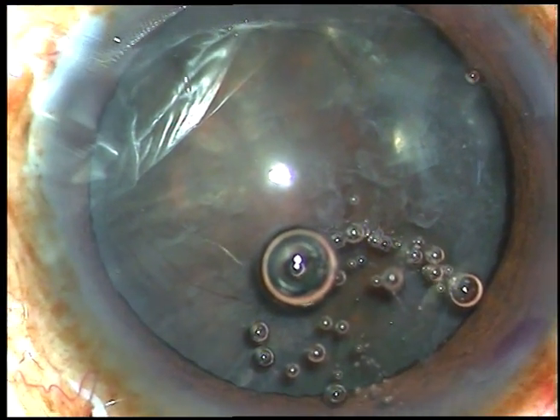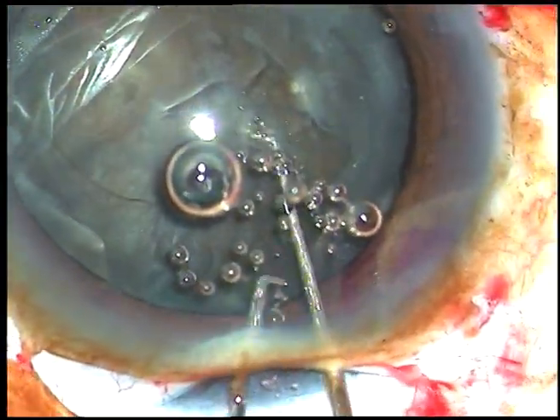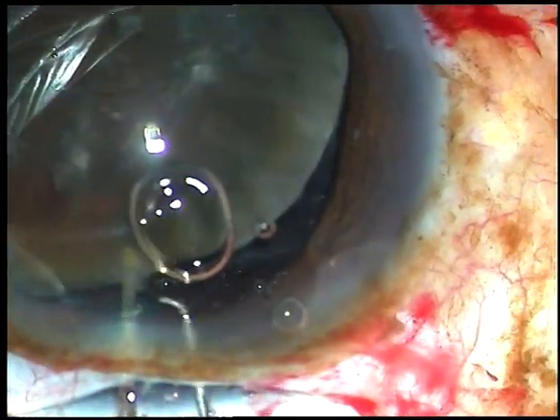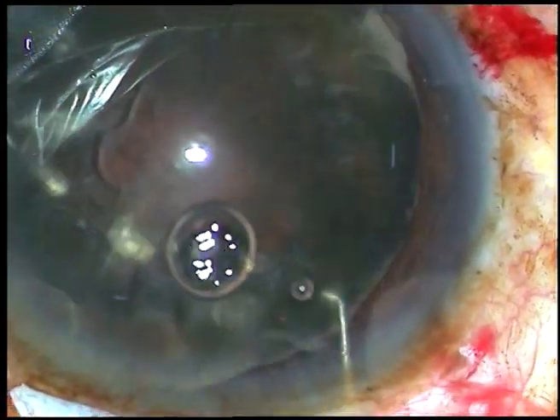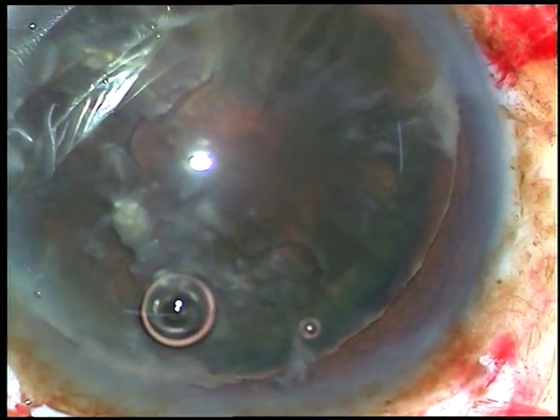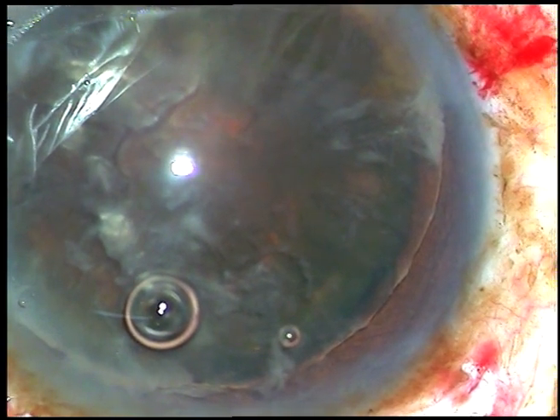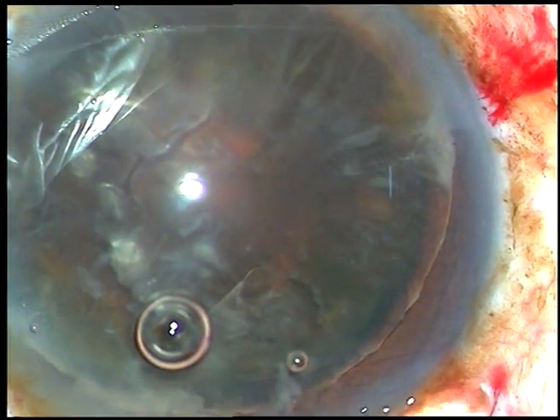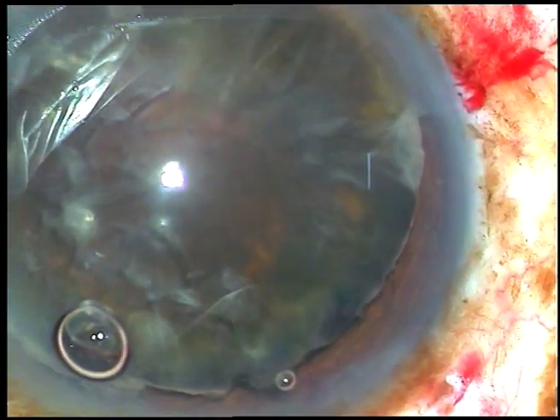Now the nucleus has to be prolapsed into the anterior chamber. Here I take two instruments — one chopper in my left hand goes behind the nucleus, and over this chopper the nucleus is rotated by the Sinski hook, and it comes easily into the anterior chamber. Now viscoelastic substance is injected in front and behind the nucleus.